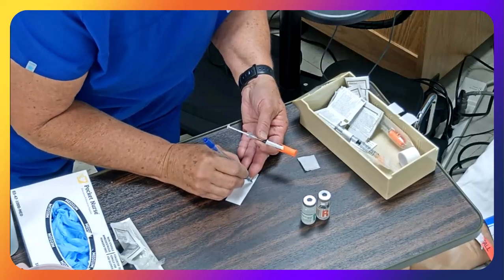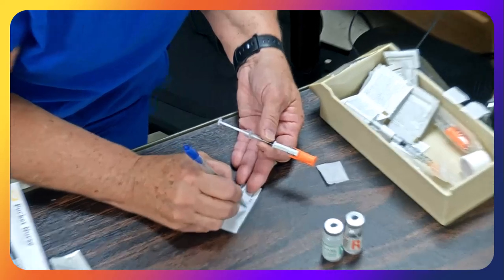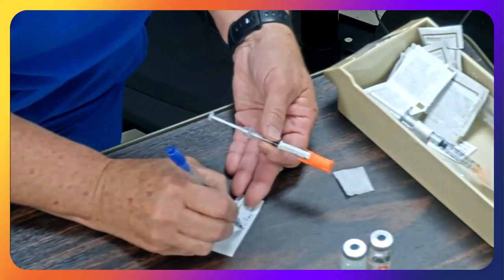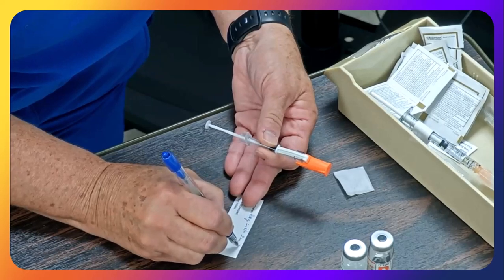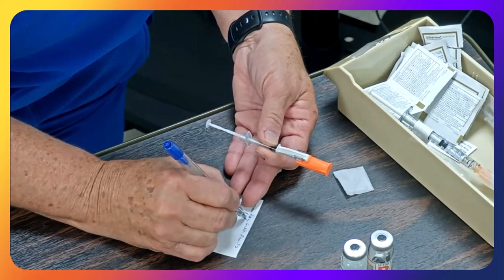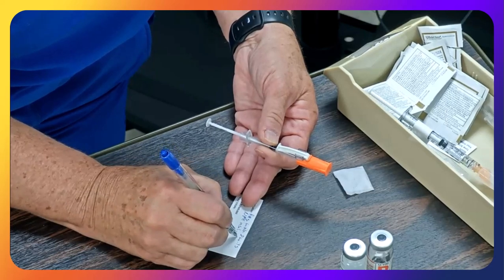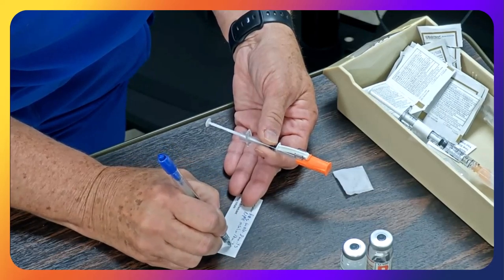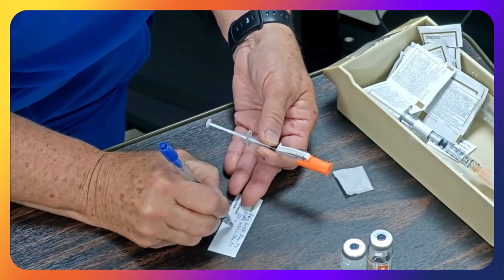So I have regular insulin, 8 units, and I have NPH insulin, 12 units, and that's going to give me a total of 20 units.